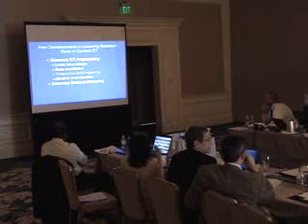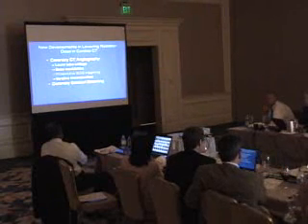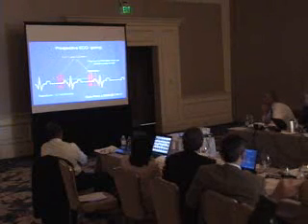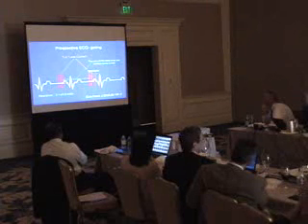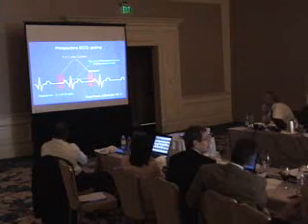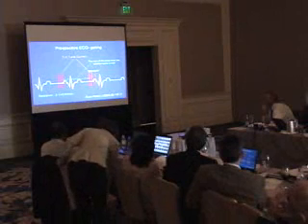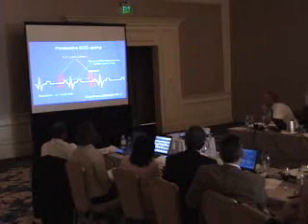Well, the whole thing really changed when prospective gating became common. It now makes up approximately half of the CT that's going on in the country. And for this approach, full tube current is used only at one phase of the cardiac cycle, and a sequential set of images are obtained without overlap between regions as is associated with helical scanning. So this is called sequential scanning or prospective ECG triggering.